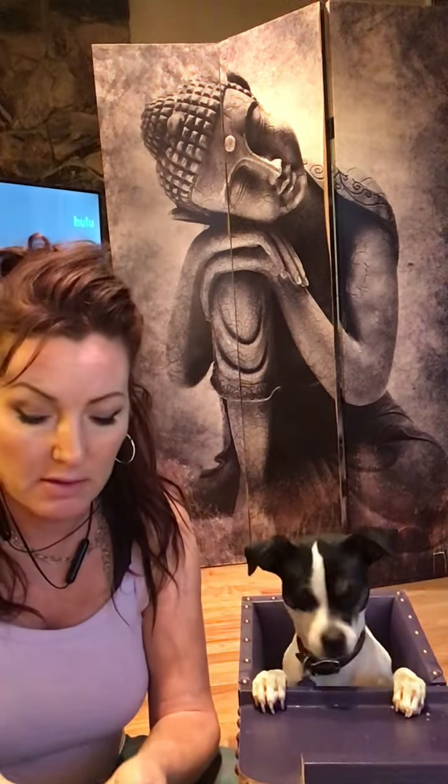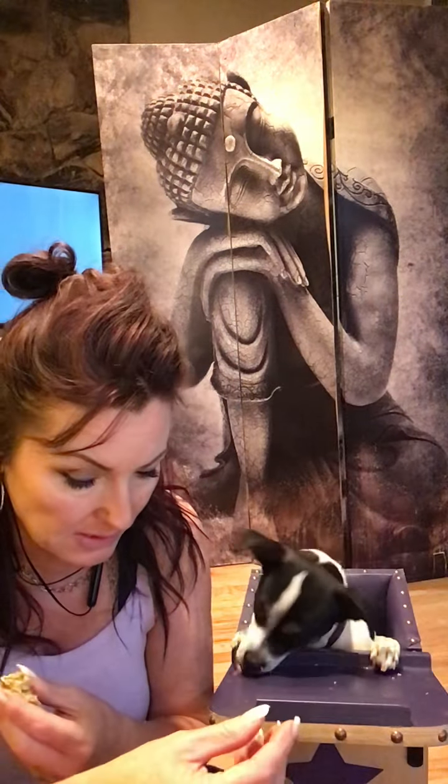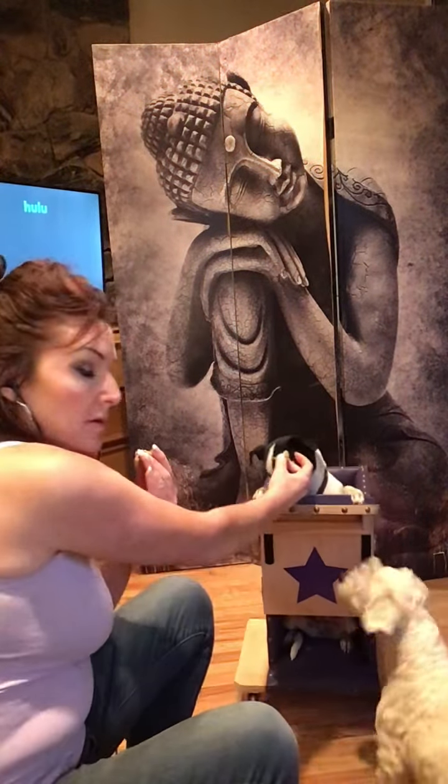Typically, after the feeding, she's going to need some time sitting in this chair. She'll need about 30 minutes. I've been giving her 30 minutes in the chair. The other problem that we have is that the water intake can't be controlled when there are too many dogs here. Last week I had 6 dogs here for the day, for the week, so I can't not put the water out. Sit, Pumbaa. Pumbaa, sit.